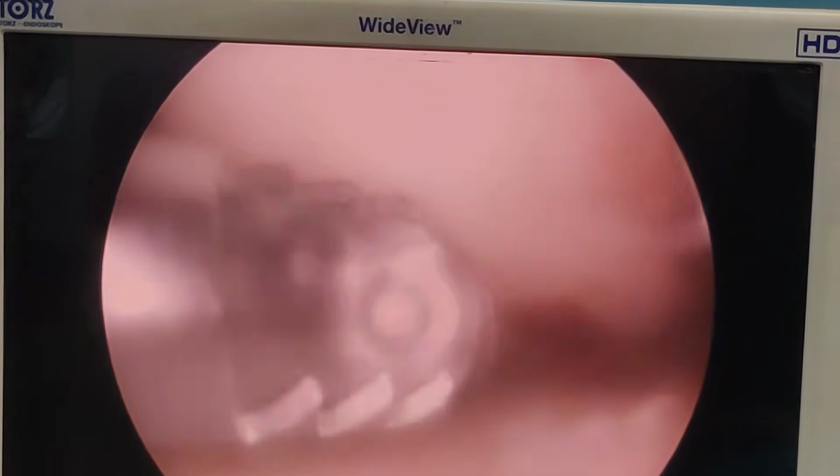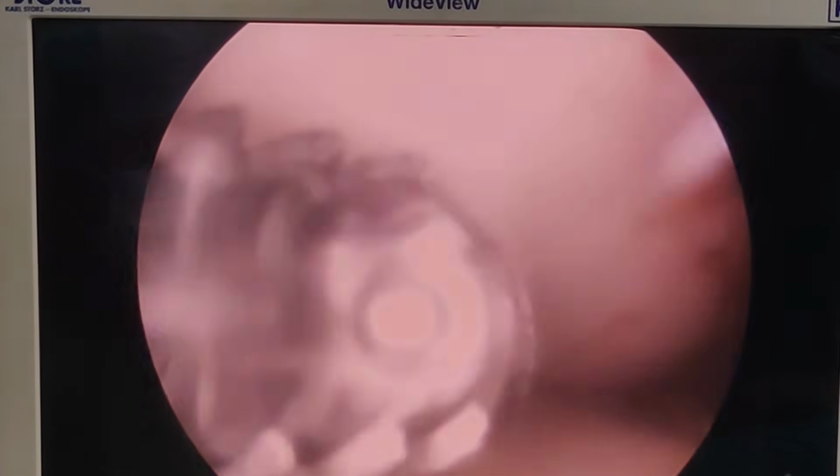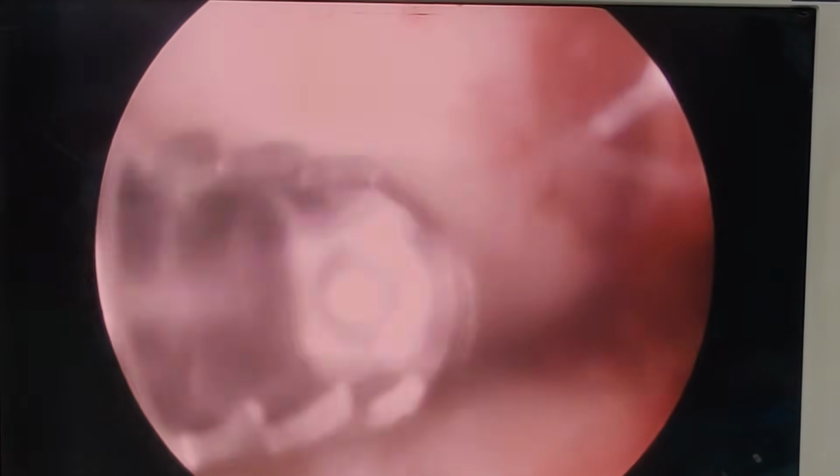Now this is also an important part of the operation, to clear the debris, because there is a lot of bone debris that is generated. So you just want to clear it till you see properly. And also while tightening the screw, when I was so involved, I was saying to do a posterior draw. No, you do an anterior draw because you want to bring the tibia in the front, and then you want to tighten the screws in a position where the graft is at optimal length. So it's anterior drawer, not the posterior drawer.